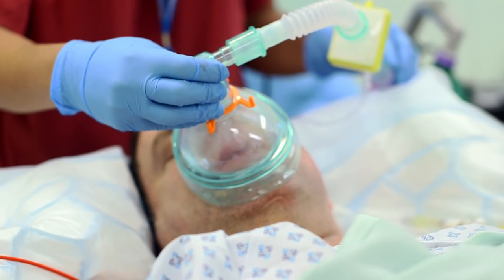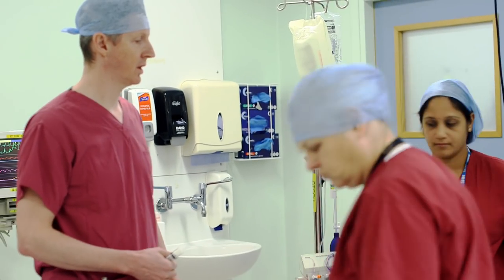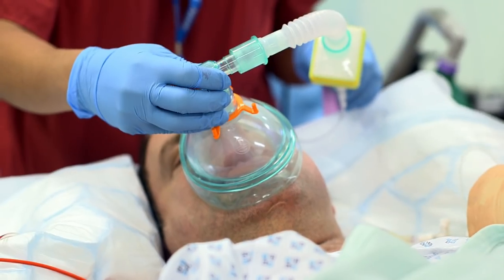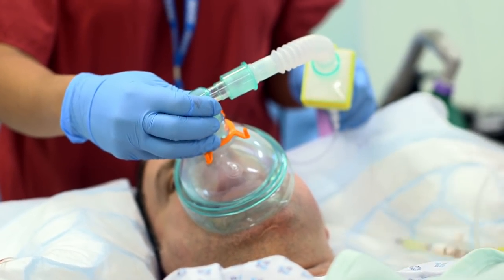Today, we are going to replace this aortic valve by doing open heart surgery and replace it with a mechanical heart valve. Prior to admission, he will have all the blood tests, X-ray, and ECG, and then he would have seen an anaesthetist the night before. Then in the evening, he would have had a full shave on his chest.